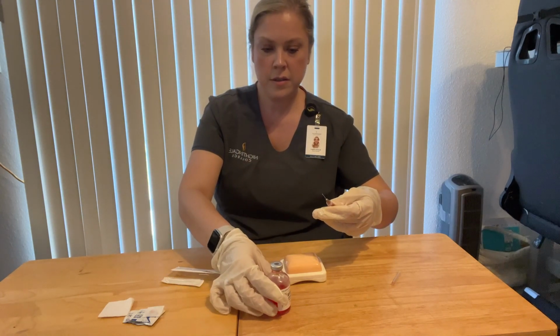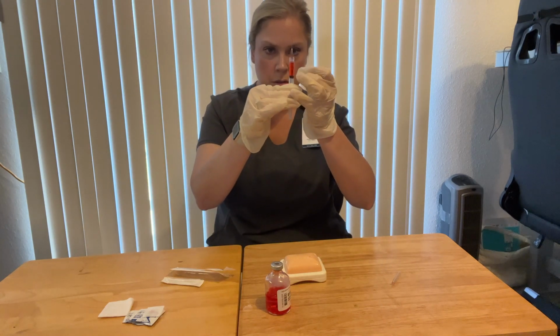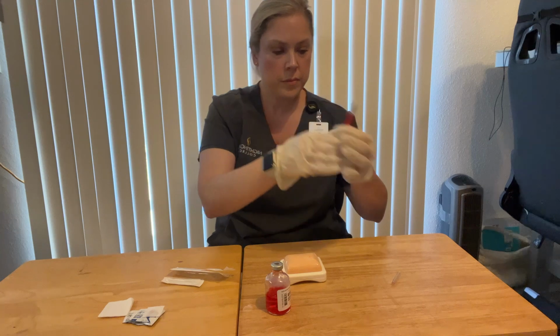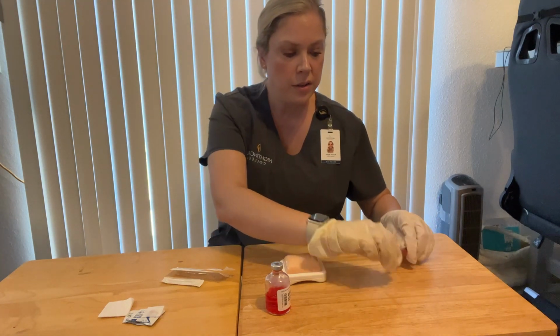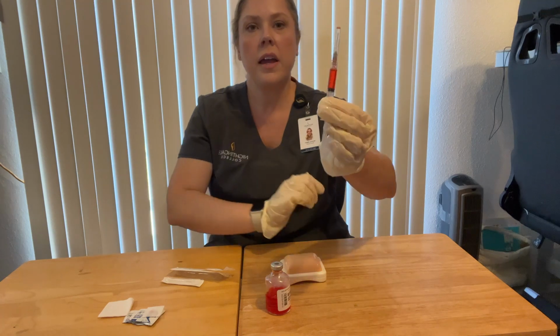Perfect. I'd want to go ahead and tap any air bubbles out. Okay, safely recap the needle. Again, verify that we have 1.5 milliliters in our syringe here. You can see that.